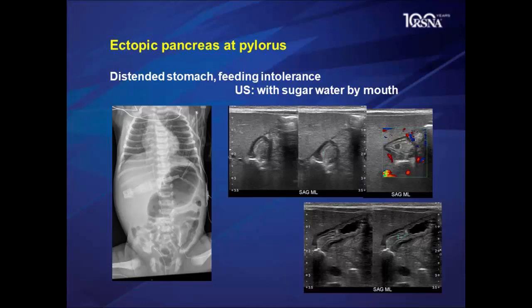Now, a rare case, but I wanted to show you this one because the patient is having feeding intolerance, and when we take a classical film, one is struck by this discrepancy in size of the gas in the intestinal tract. This is more dilated than this. So we think about high level or upper proximal level of obstruction. Ultrasound is handy. So we go for a pyloric stenosis. Well, that's what we see.